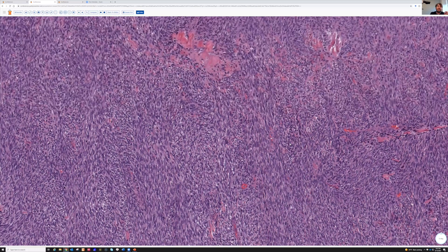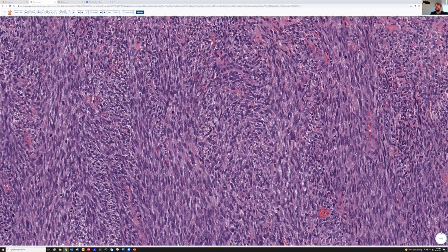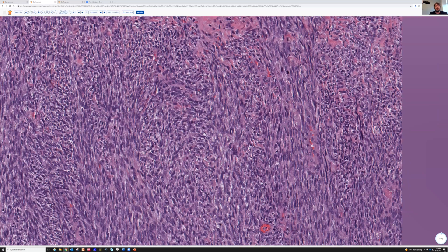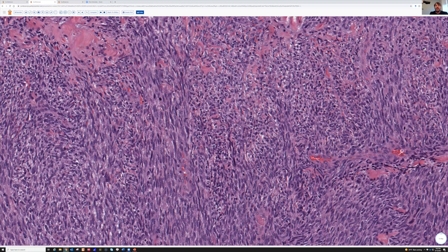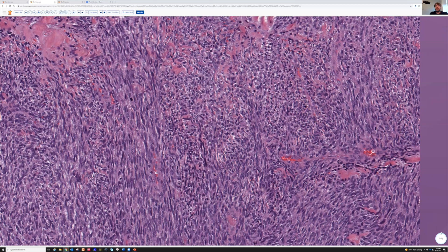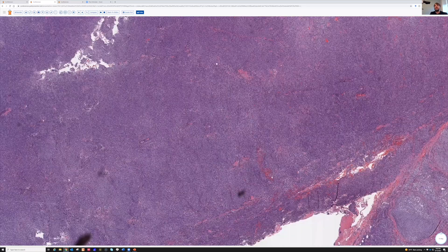One thing that stands out — and it's kind of subtle, particularly in this case — is that there is a bit of pleomorphism here. With practice, you can begin to recognize that this tumor looks a bit different than synovial sarcoma. But as a fellow, I thought that was impossible. Over time, I learned features that helped me. This tumor is a malignant peripheral nerve sheath tumor — another tumor well known for making fascicular cellular fascicles with a herringbone architecture.